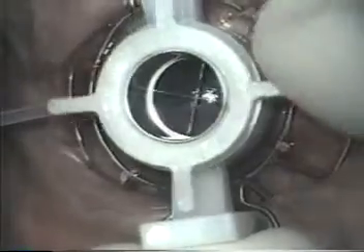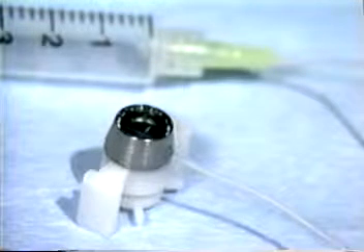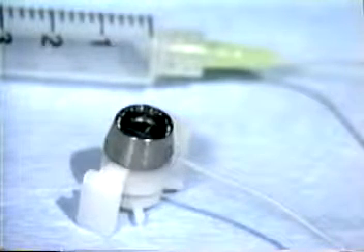For each spoke turned, the blade is lowered or raised six hundredths of a millimeter. The Barron radial vacuum trephine is available in diameters of six to nine millimeters in half millimeter increments.